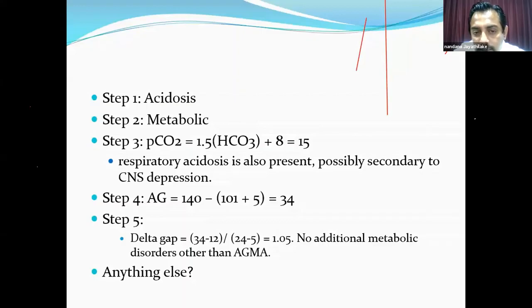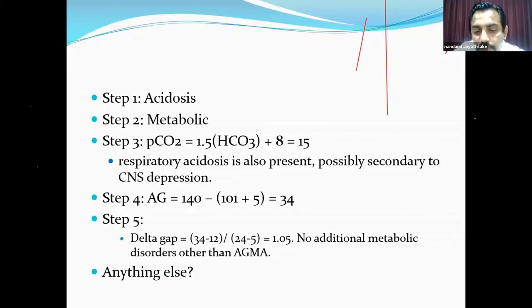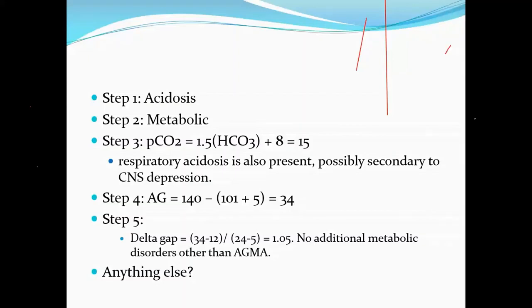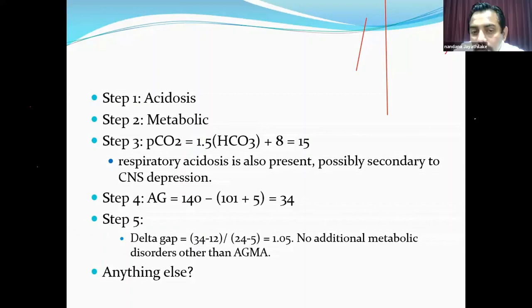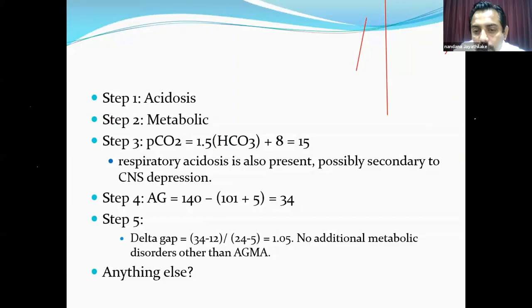Anything else you want to know which I have not given? So, high anion gap metabolic acidosis partially compensated by respiration.